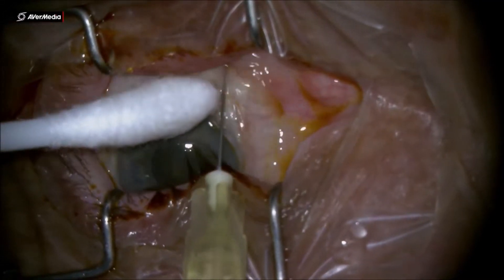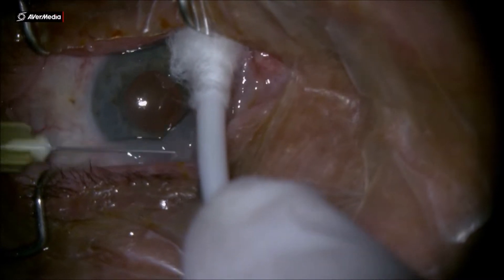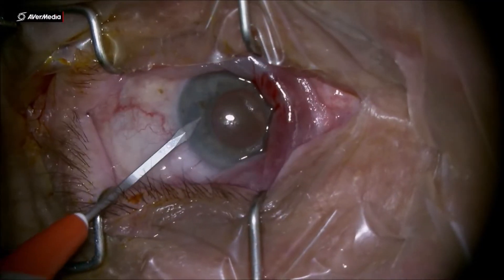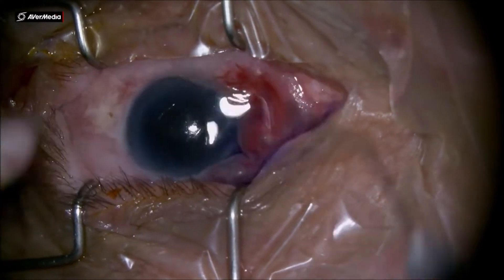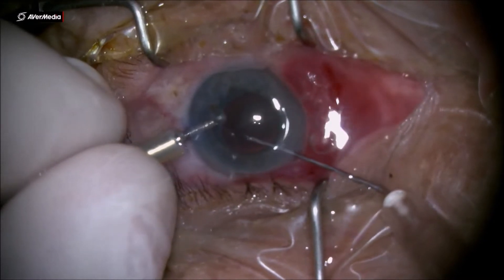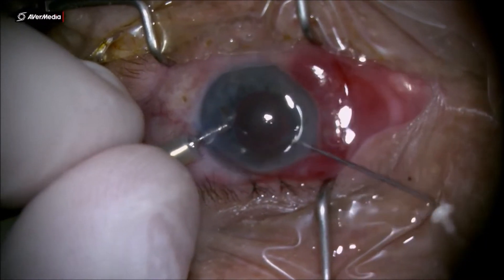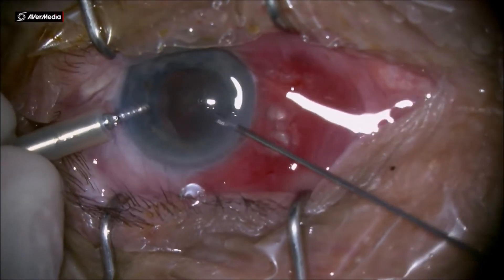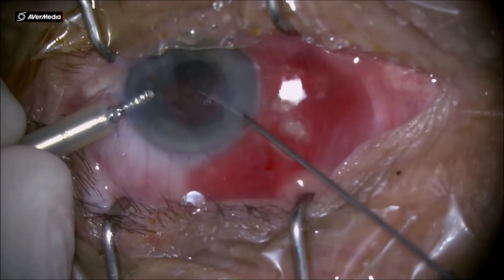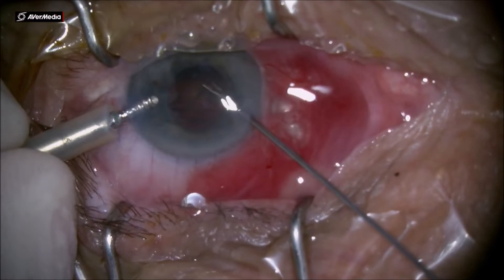Dear colleagues, this is a case of closed angle glaucoma cataract with nucleosclerosis of 2+. Notice the fact that the pupil is not very well dilated and I'm going to use in this case the Mishev chopper to finish the case in a safe manner.